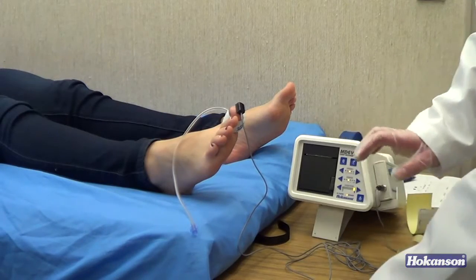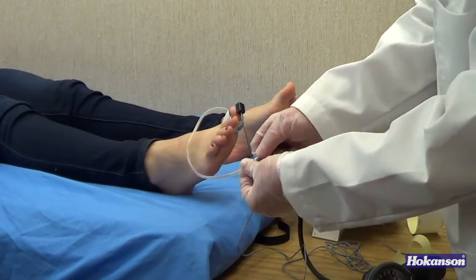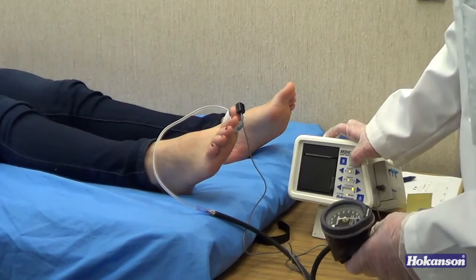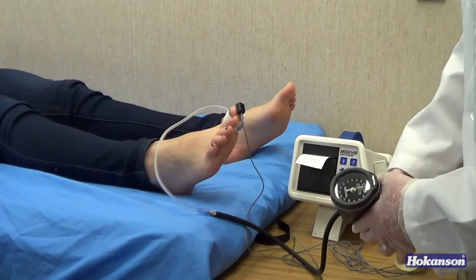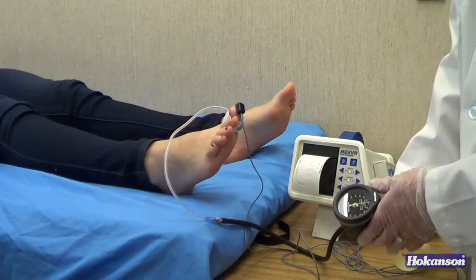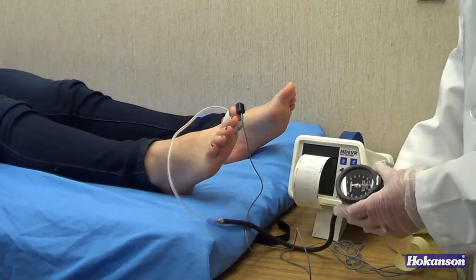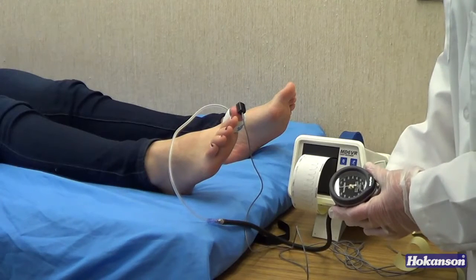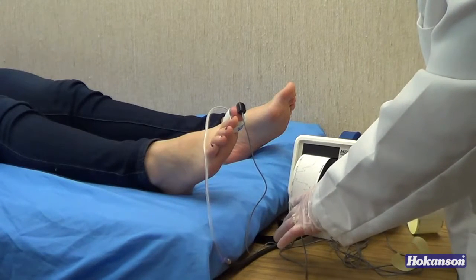And now to measure the toe pressure, we hook up the sphygmomanometer to the toe cuff and we run the paper again, and we inflate the cuff until the waveform disappears. That ensures that we've gone above the systolic pressure, and we should go 20 to 30 millimeters above the pressure where flow is occluded.